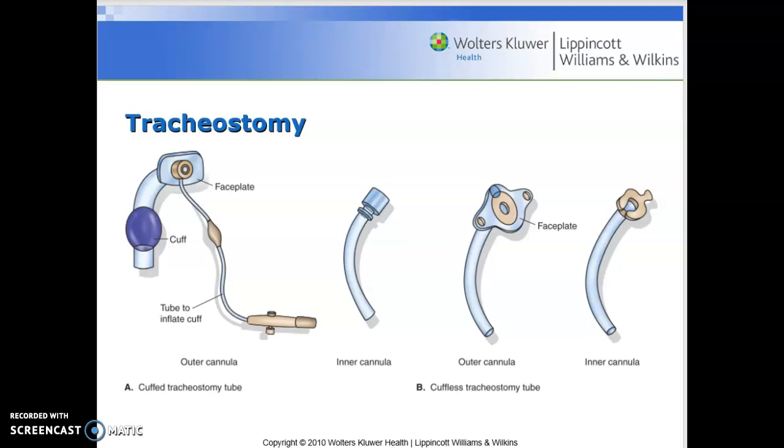We often see this with patients who have been paralyzed for long periods, and you guys will learn how to clean the tracheostomy, and we're going to go over that in lab. But in the meantime, I want you to know your steps and be able to answer questions for it on the test. The ties secure the tracheostomy to prevent it from dislodging, which I'm going to show you in lab.